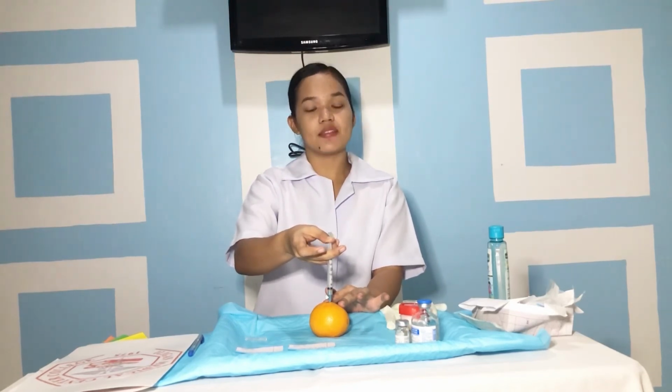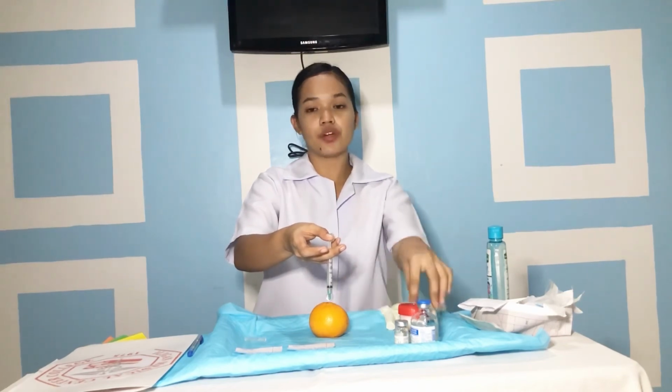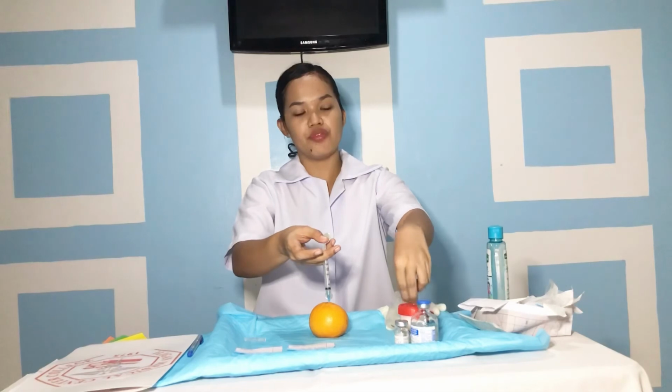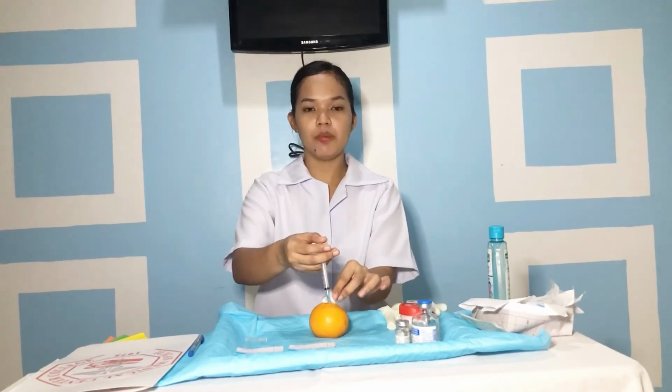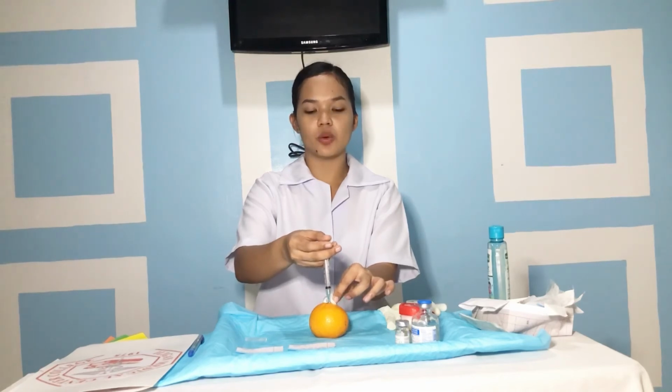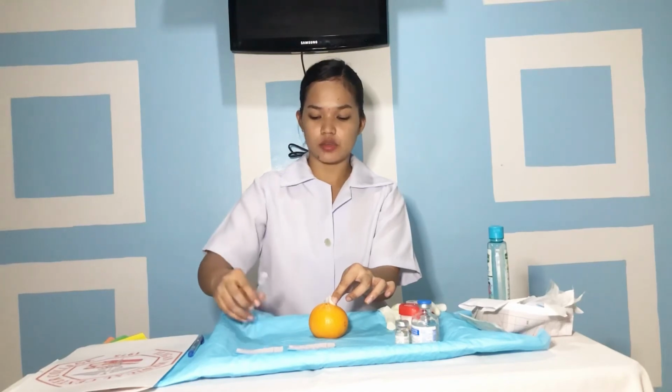So at this time, it is necessary to ensure that the needle is not in a blood vessel. So then, smoothly and steadily withdraw the needle and release the skin. So this will allow the medication to absorb into the muscle rather than leaking back out through the tract that the needle created. So we withdraw the needle while applying an alcohol swab or gauze gently over the site. And then we dispose of the syringe.